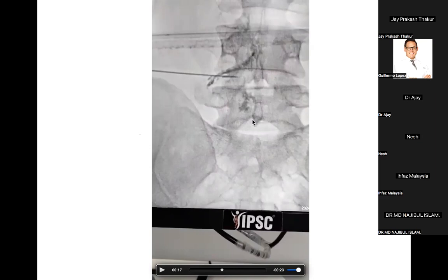Secondly, the dural sleeve will come up to the foramen only, whereas your contrast is going out of the foramen also. So that's why it's not in the dural space. But good, you asked that. Anything else? No, sir. Clear.